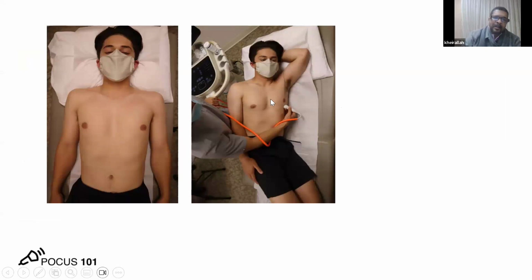Okay, in the left lateral, we get the parasternal, which is here, the apical, which is here. And from this position, we get the subcostal, which is here, and suprasternal, which is here. So we have 4 windows, or you can say 5 windows, of which the fifth one is the right parasternal. This is used for special circumstances, like when we are looking for aortic stenosis and high gradient, and we use a different probe. The conventional windows are 4, okay?